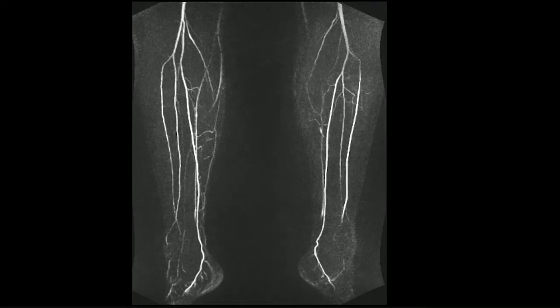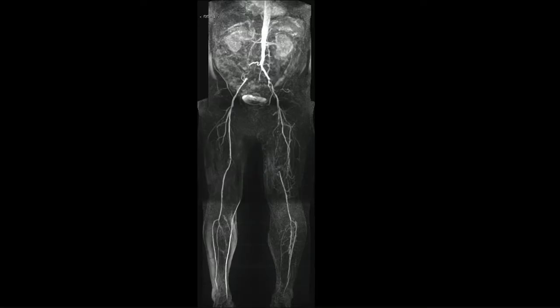And this even shows some early venous filling up the short saphenous vein on the right. You can see how quickly that transits through, and this patient will almost certainly have a very extensive venous overlay on the tibial angiogram. And these are the sort of images that you can achieve.